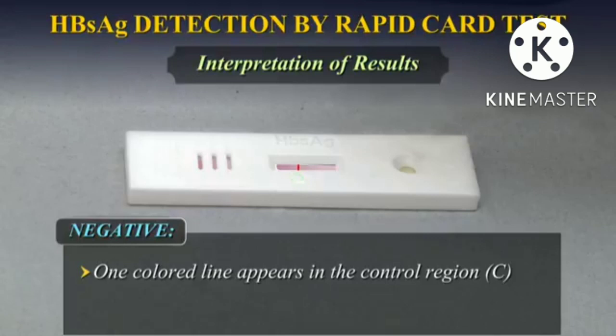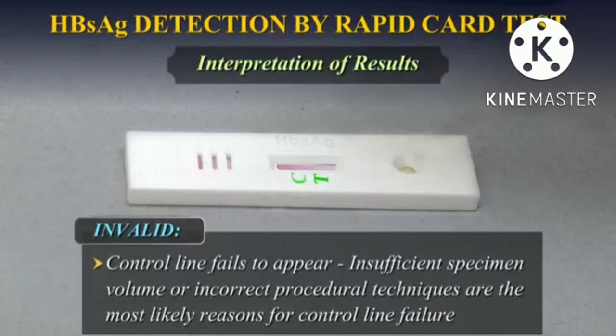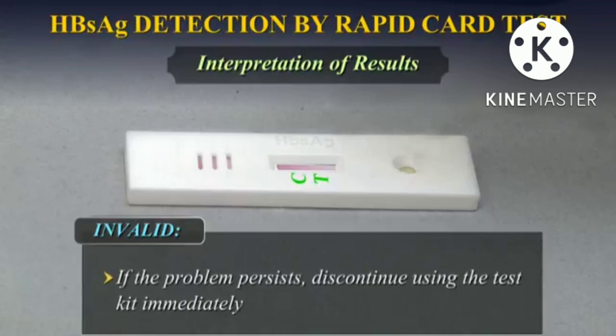Negative: when one colored line appears in the control region C, no apparent colored line appears in the test region T. Invalid test: when control line fails to appear. Insufficient specimen volume or incorrect procedural techniques are the most likely reasons for control line failure. Review the procedure and repeat the test with a new test device. If the problem persists, discontinue using the test kit immediately and contact your local distributor.